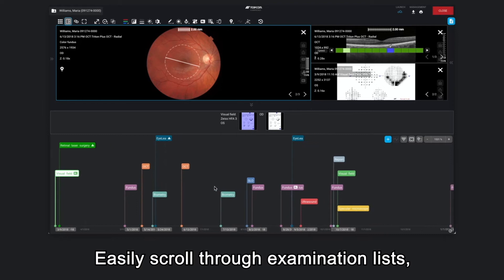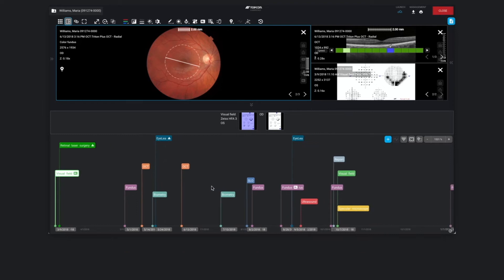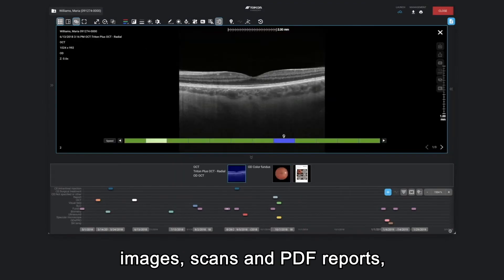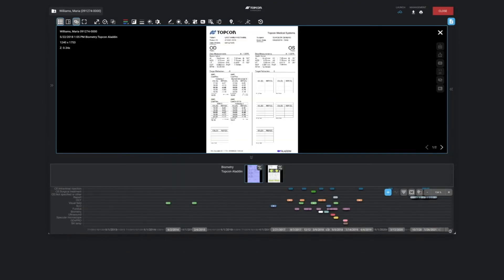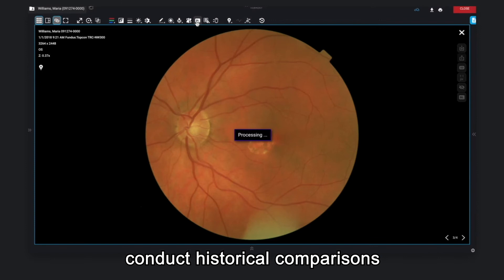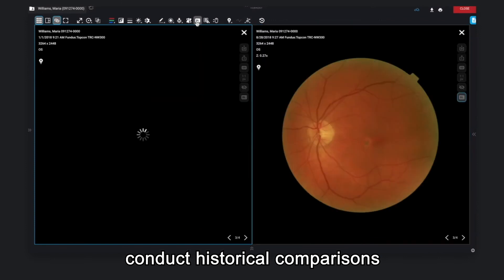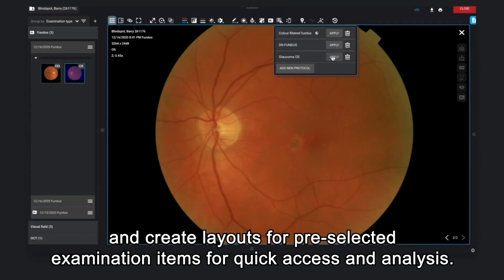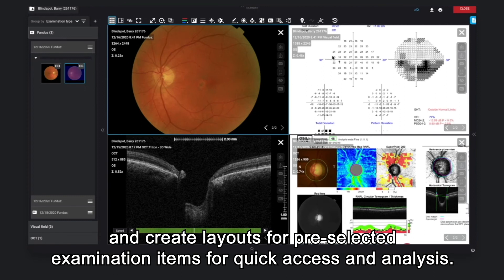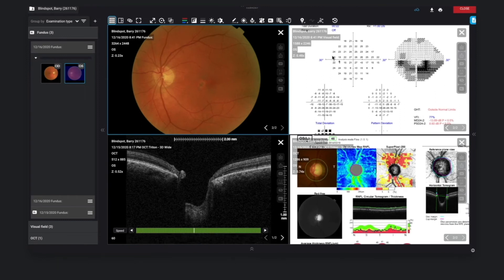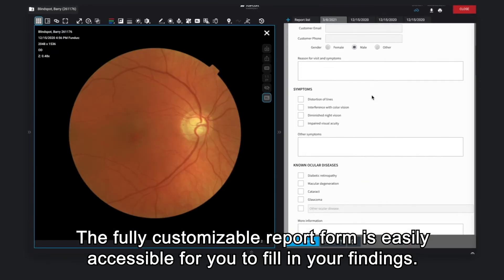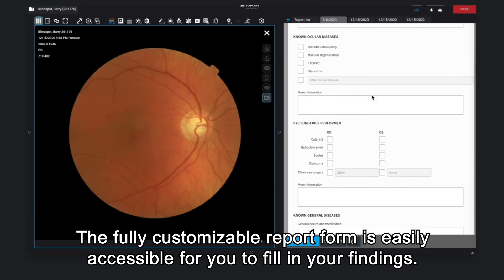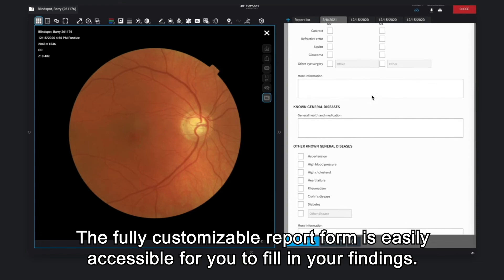Easily scroll through examination lists, images, scans, and PDF reports, conduct historical comparisons, and create layouts for pre-selected examination items for quick access and analysis. The fully customizable report form is easily accessible for you to fill in your findings.